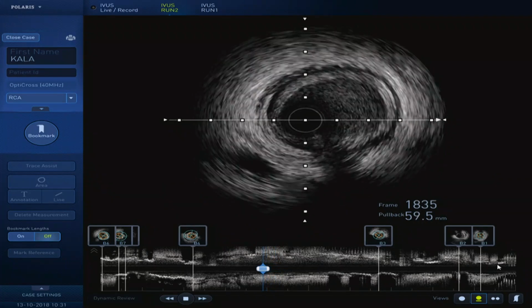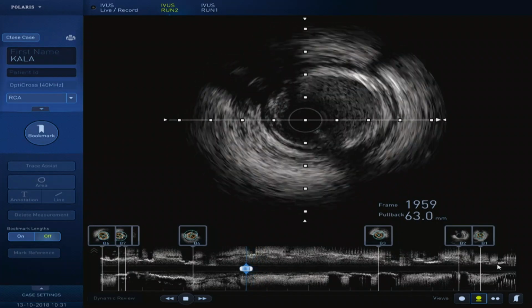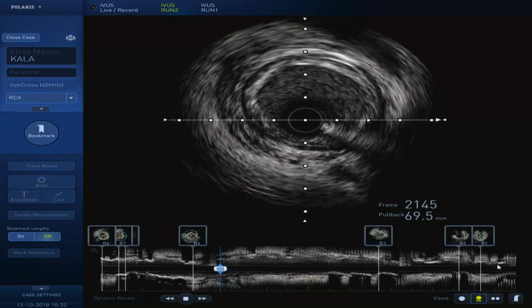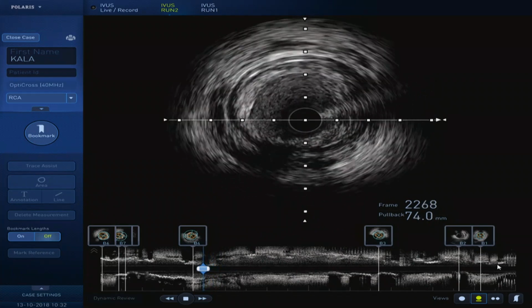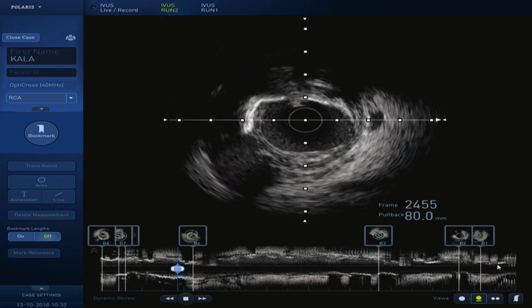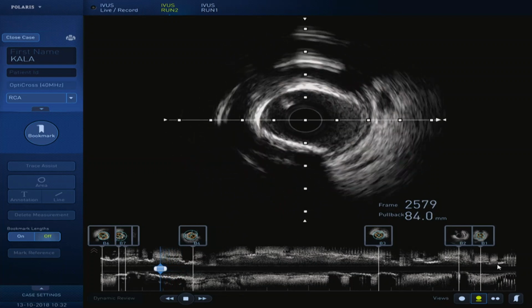It's quite a large vessel, even in its distal aspect. That's a 4 millimeter. Yeah, absolutely. Media to media, 4 millimeter, absolutely. So there's a bit of a size disparity between the PDA and the RCA, and we're just about to arrive now at the mid vessel, where all the action is. Again, fibrocalcific disease there. We've prepared this, so you will see some cracks within the calcium.